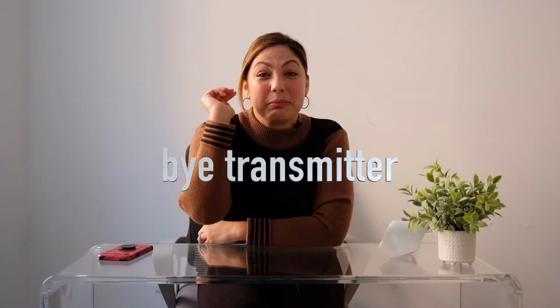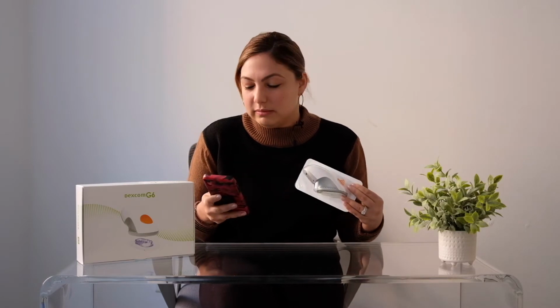I use an app. A lot of people also have a little transmitter item. I don't do that because I have an iPhone. So essentially you can see your number right here. I'm 159. I just had breakfast. I'm hoping to get that down a little bit. And essentially, once you put it in, sync it up, you can see it all day. Every once in a while, you'll have a little bit of a can't find meter situation. Those usually resolve quickly. If they don't resolve in 30 minutes, you should probably call Dexcom.